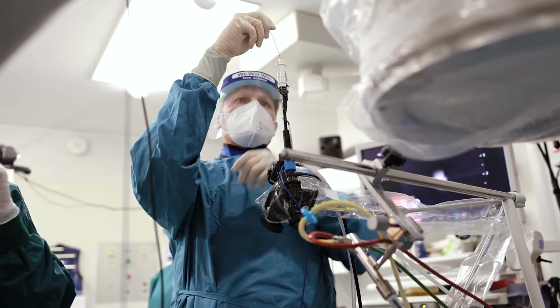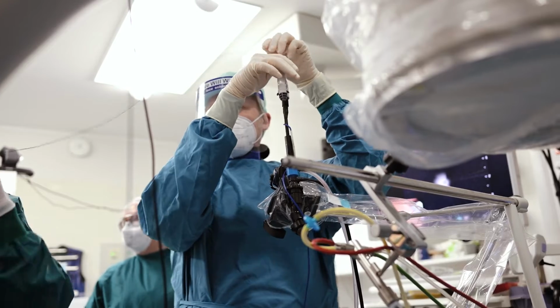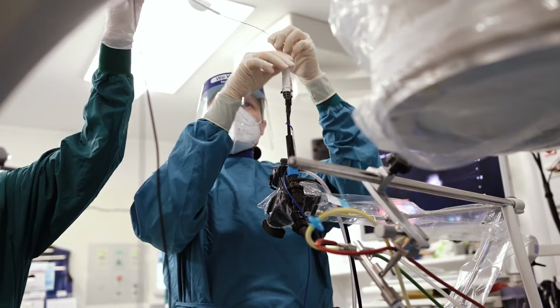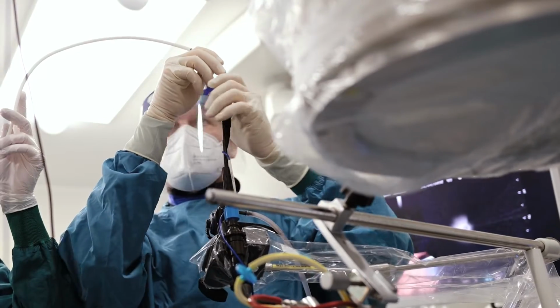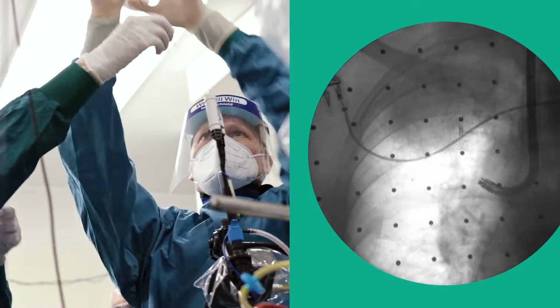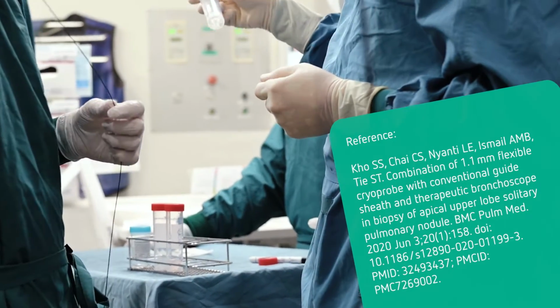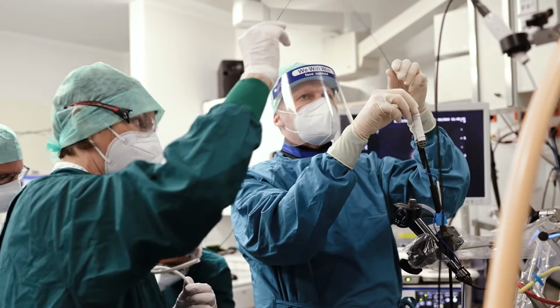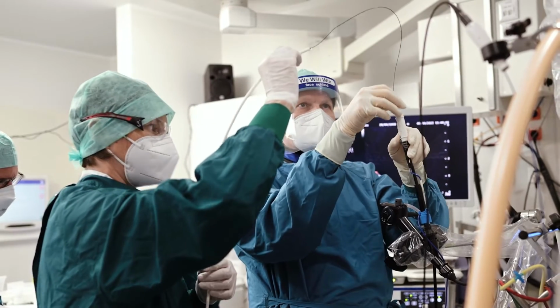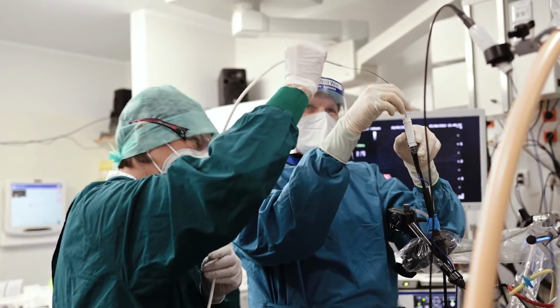The flexible, single-use 1.1 mm cryoprobe is introduced into the extended working channel. Under fluoroscopic guidance, it is advanced to the exact same position the radial EBUS probe was in before. Since deflection of the extended working channel's tip is only minimal, this reduces the likelihood of missing the lesion. Furthermore, tangential freezing allows for sampling in cases where the solid consistency of the tumor impedes opening of the forceps jaws.